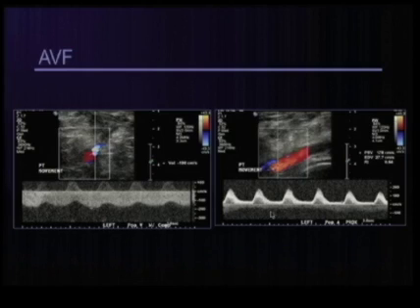Okay, one other finding here, patient with lower extremity edema, no DVT, but as the vein was being imaged, you can see that there is an arterialized flow pattern in the vein, which prompted imaging of the associated popliteal artery. This is not the normal appearance to a lower extremity arterial waveform. This is actually decreased in resistance, and the conjunction of these two findings is most compatible with an arteriovenous fistula. Sometimes the fistula may not be seen, but this high arterialized flow in the vein is enough to make the diagnosis.